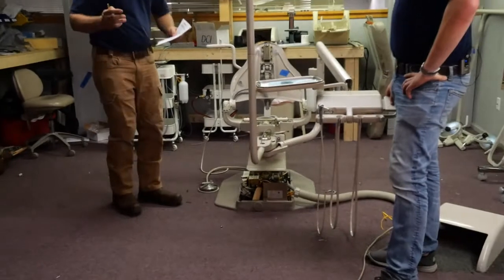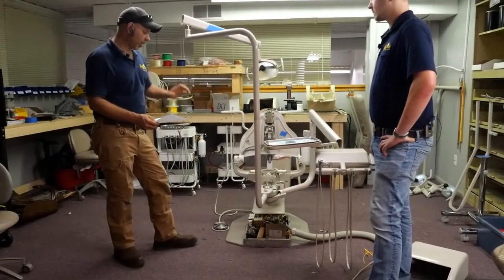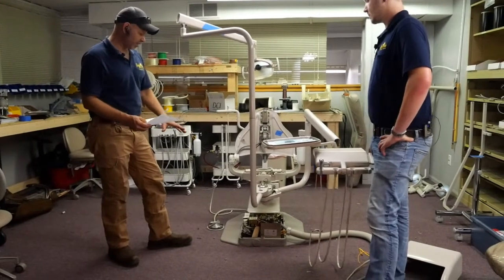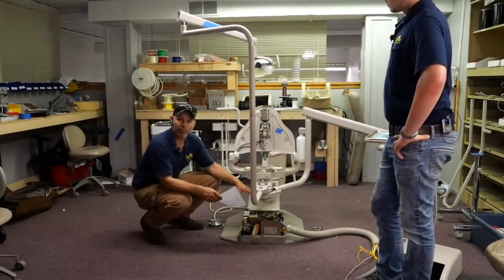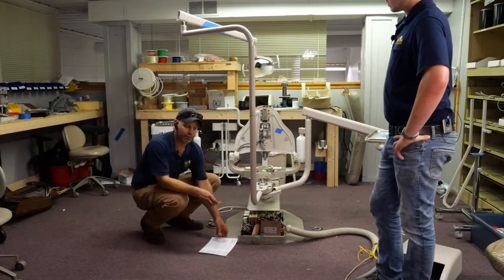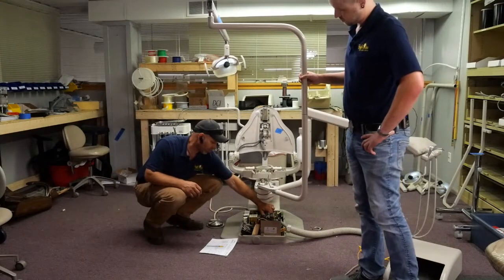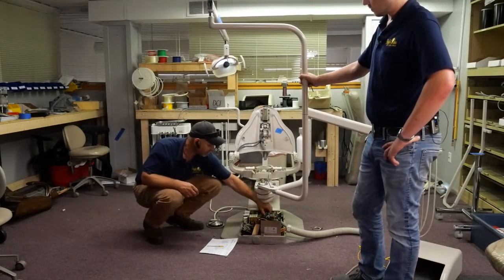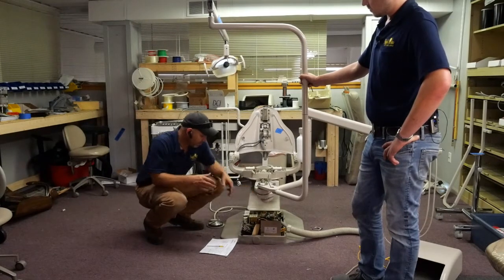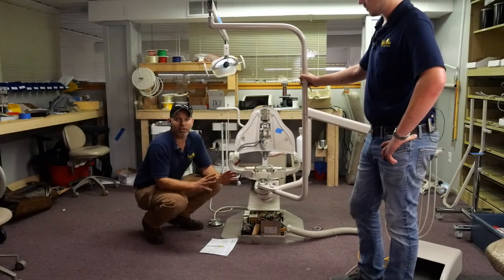Now, I said we'd also give you a couple other tips here regarding the system. The first is that this access is actually where you also fill your hydraulic fluid. This is right here. This is a hydraulic reservoir, and there's a cap with a couple hoses going into the top of it. The real basic procedure, we'll start here.